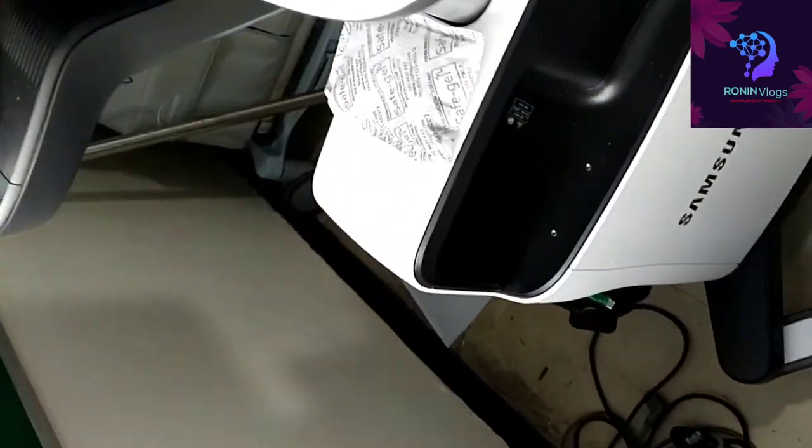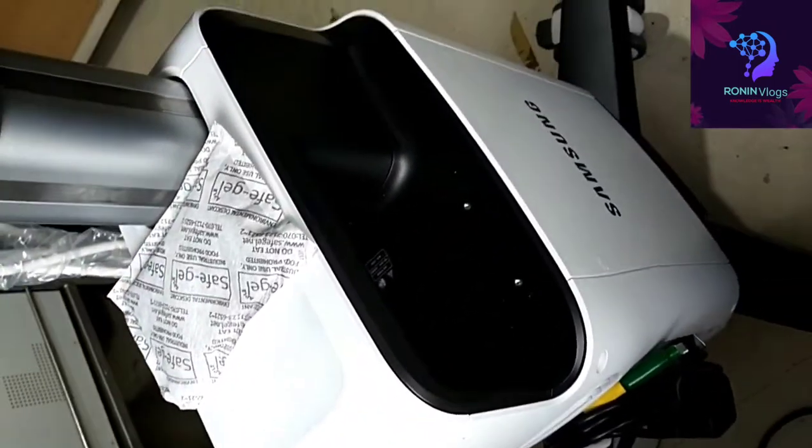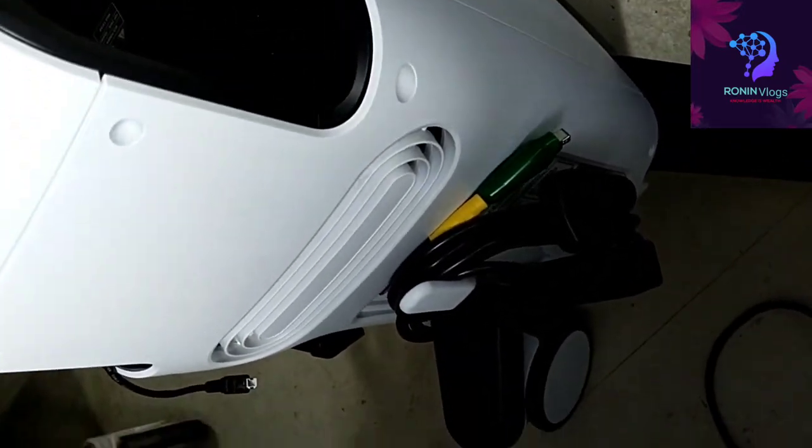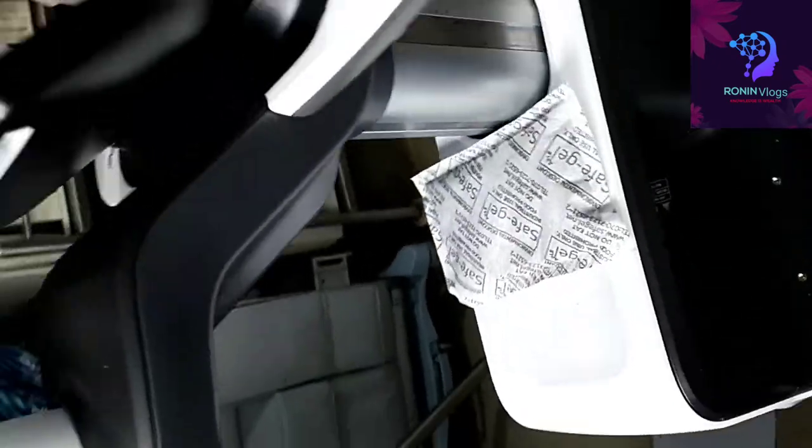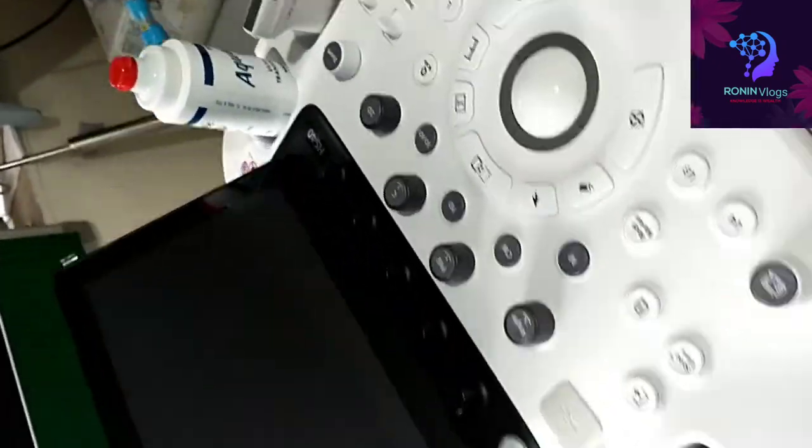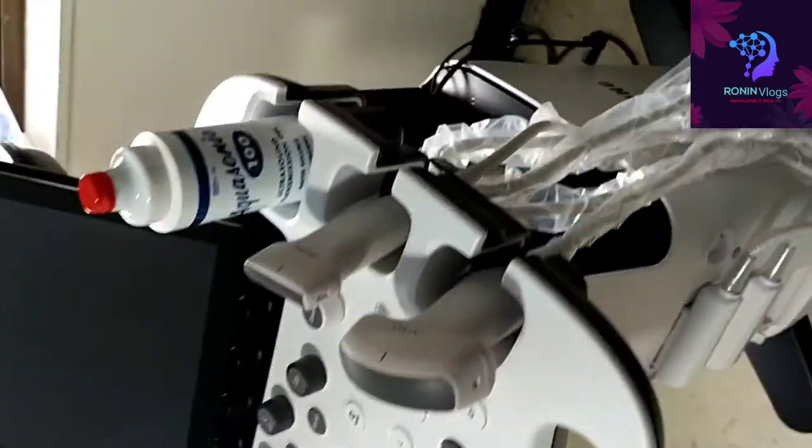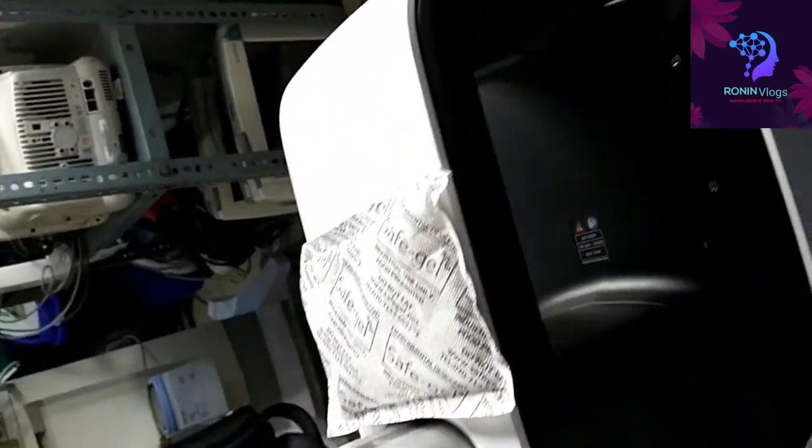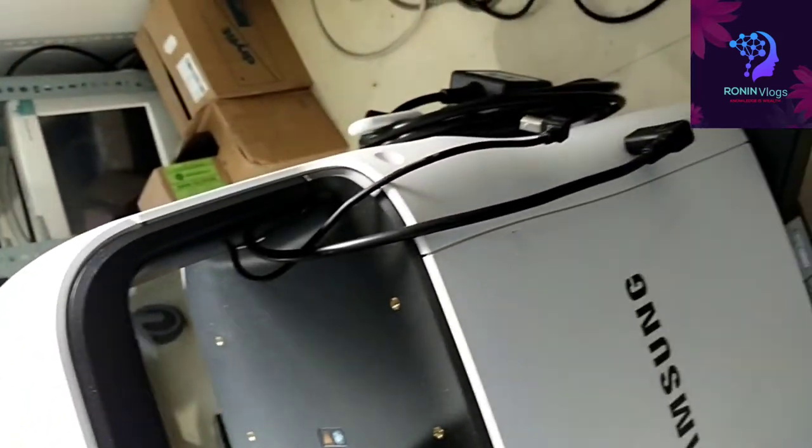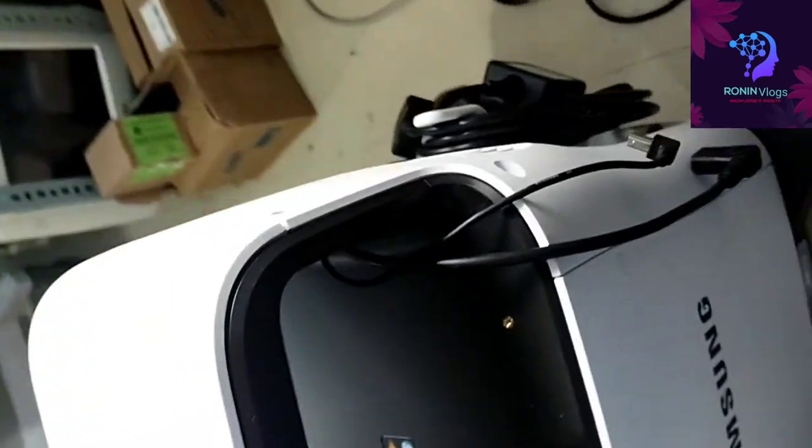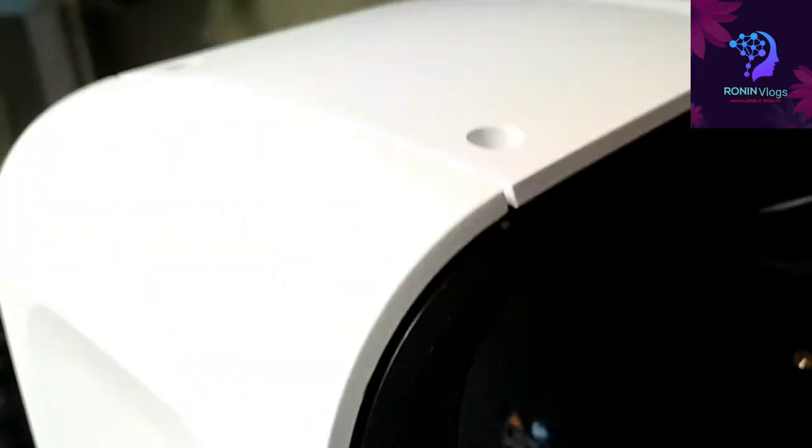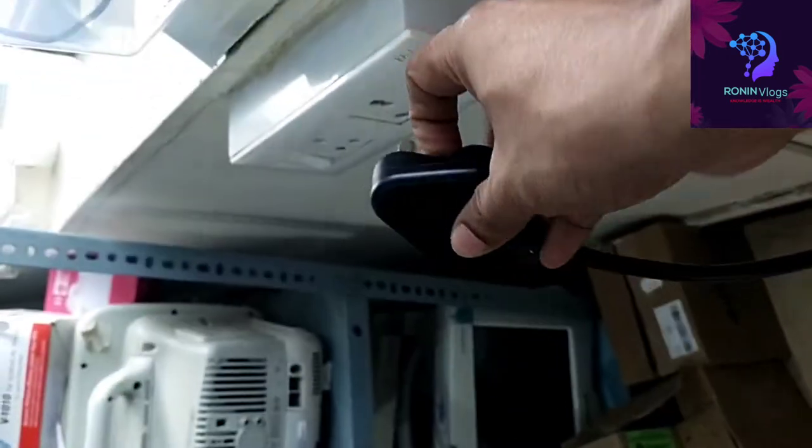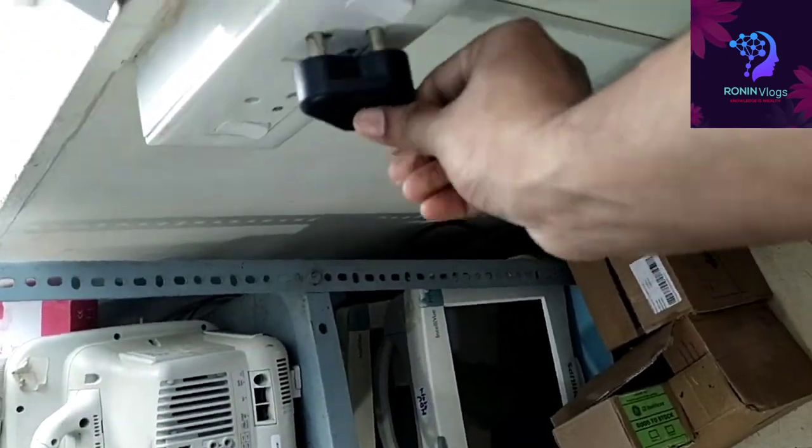The back side has the main power supply. This side has options for a printer, including printer power supply and printer connection. This is the main power supply. We need to plug it in and switch on the machine.